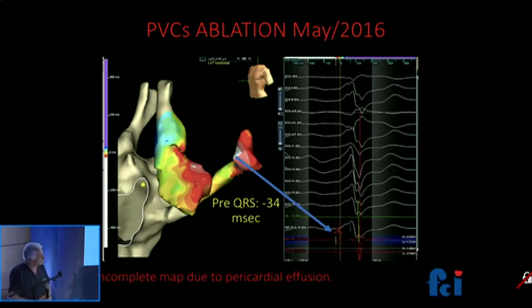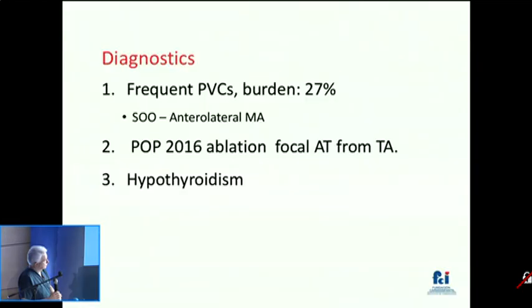When the ventricular extrasystole was going to be mapped, we had some information of earliness in the coronary sinus. We had problems passing a sheath, and there was hemopericardium, so the procedure was interrupted at that time. After that, she was taken to pericardiocentesis with no additional complications for the patient, and at present the diagnosis is frequent ventricular extrasystole with a 27% arrhythmic burden.